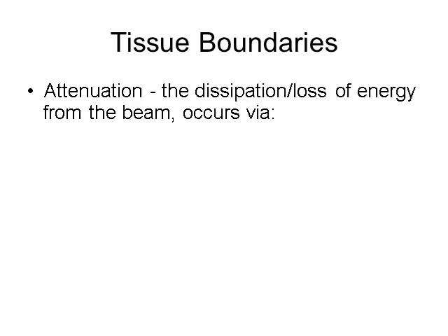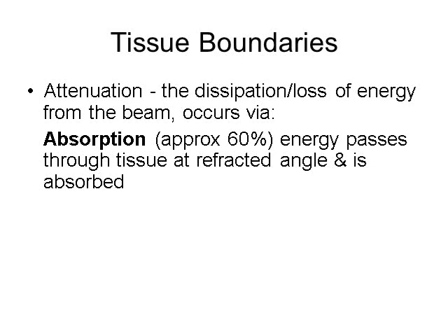Attenuation describes the loss of energy from the ultrasound beam, and this occurs due to absorption, which accounts for about 60% of attenuation as the wave passes through the tissues. The remainder is reflected or deflected to other tissue areas, where eventually it too will be absorbed. This is of course much less predictable and scattered than the main ultrasound beam, and is not considered important in terms of its physiological effects.